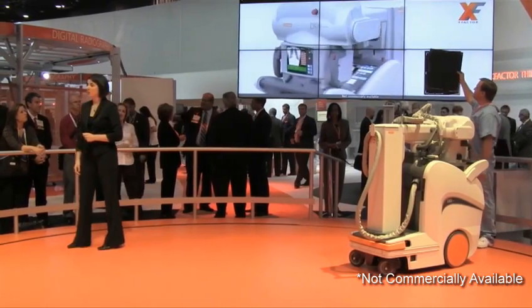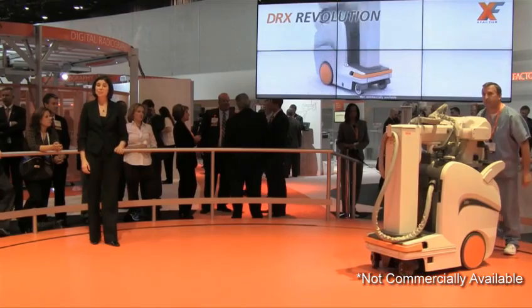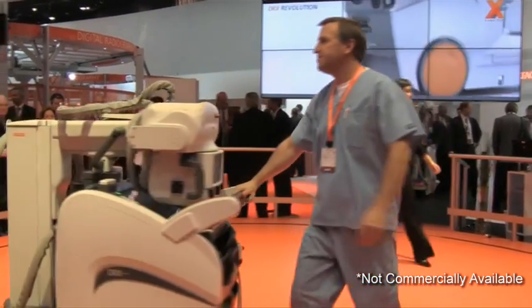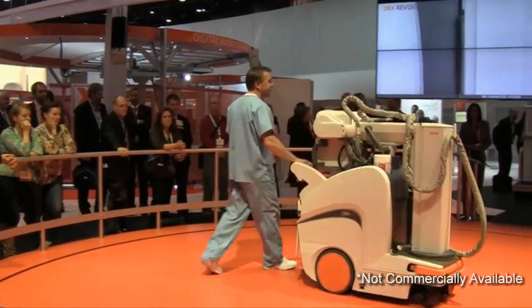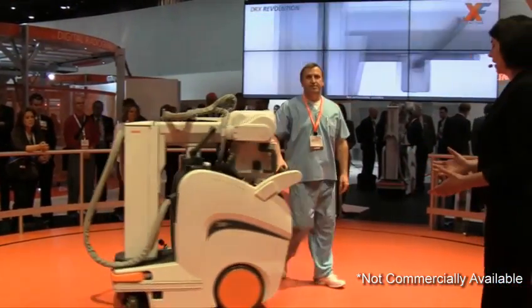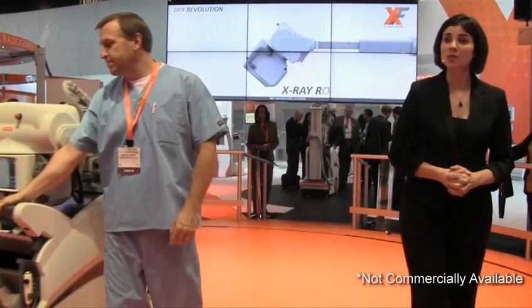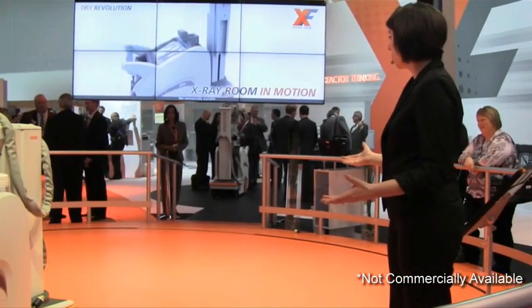And now we are proud to preview our next innovation: the DRX Revolution. The mobile x-ray system that we believe will change the way you think about DR. The DRX Revolution's intense, exceptional ability and truly revolutionary function. Based on input from clinical users worldwide, the DRX Revolution is intended as nothing less than a full-featured x-ray room in motion.